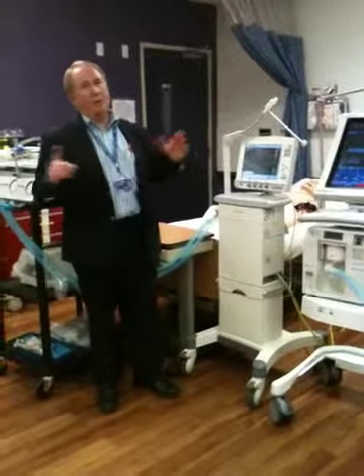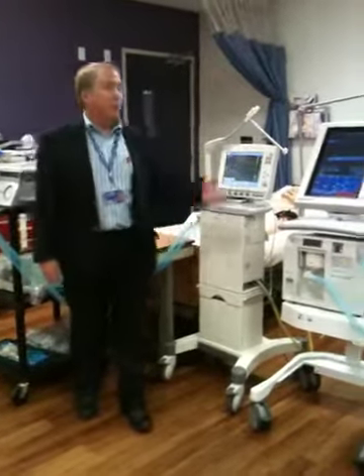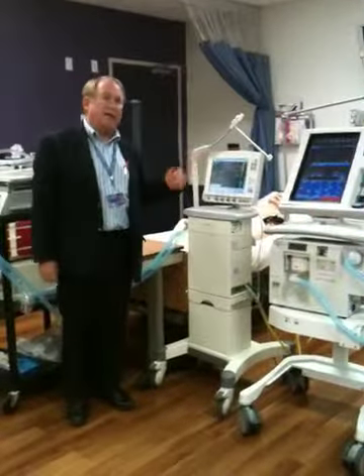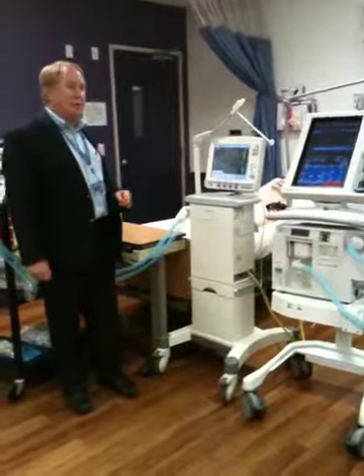It will only calculate it over a long trend. Some of them will do one breath. The Drager does it on a single breath. It does a breath hold and then releases, and it only does it when you ask it to do it.